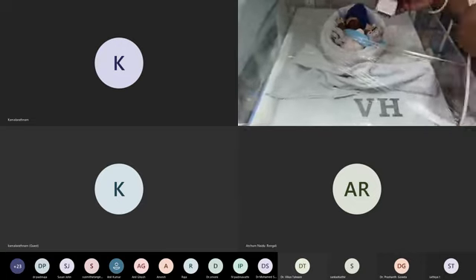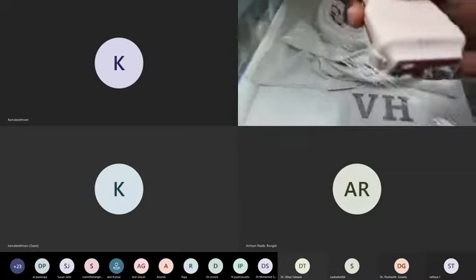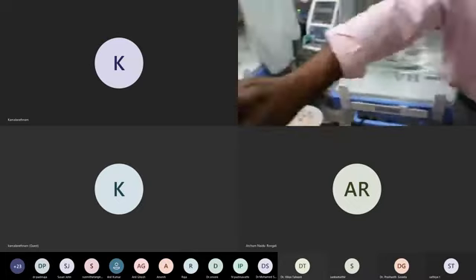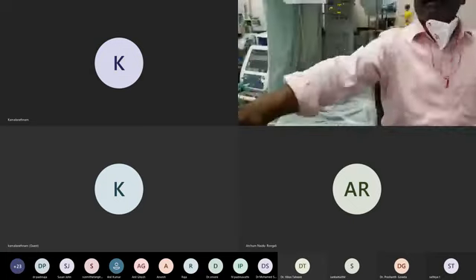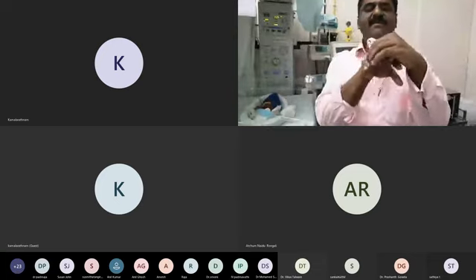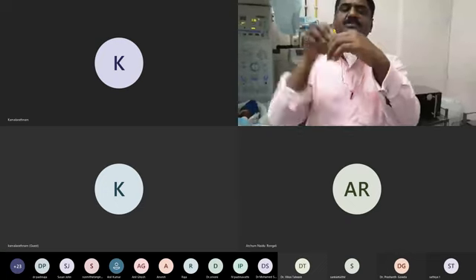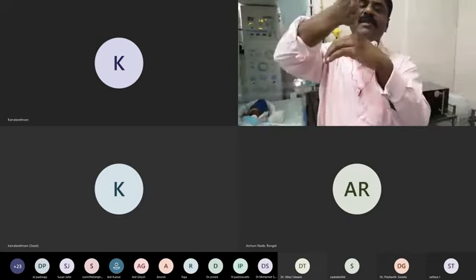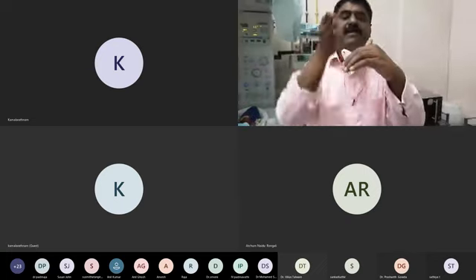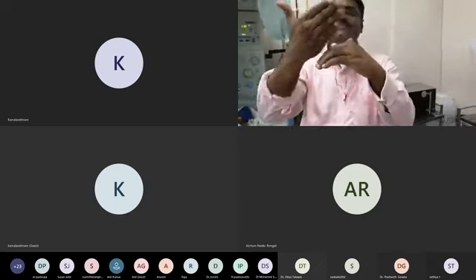So now what we will do is we'll try to take, and one more thing, dear friends, please see my hand. If the lung is like this, because the lung will be like this. It is moving like this, coming out. Moving like this, coming out. So if it is like this, you can keep the probe like this. It is perpendicular to the lung. But here also don't try to put it like this. It is not perpendicular. You have to change something like this.